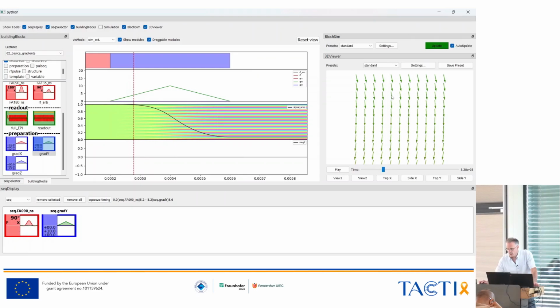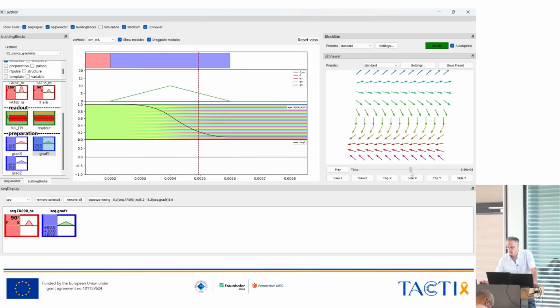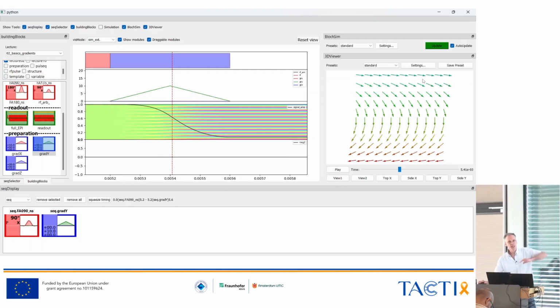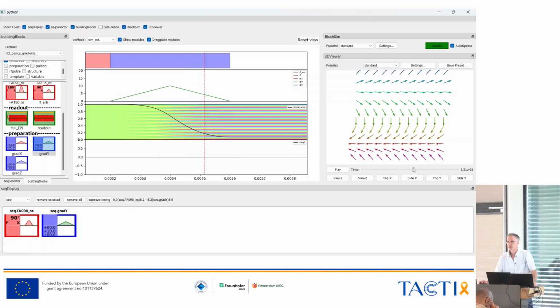So you see that the magnetization, those which are far away, you see it first because they have the strongest effect, and they will just start to precess more quickly. And you see this one up here is precessing in this direction, and down here it's precessing the other direction. Yeah, because there the field is smaller, in the other direction it's higher.